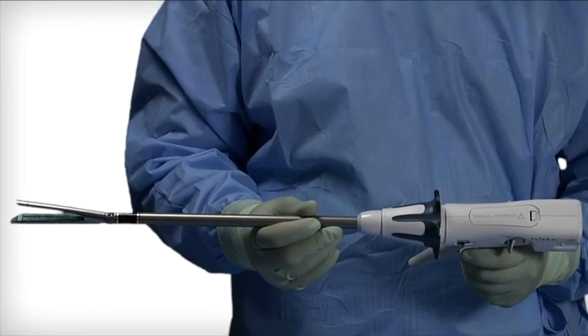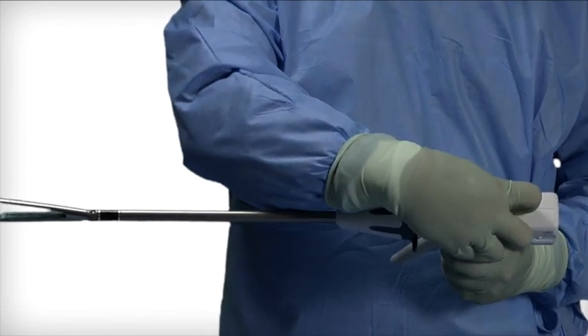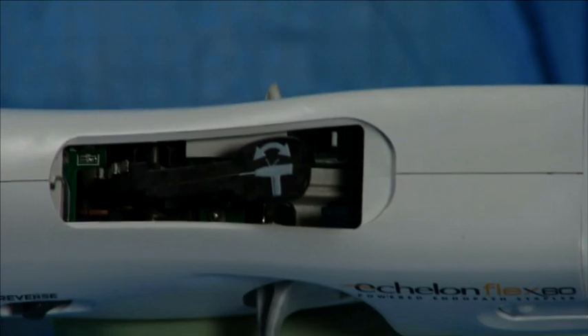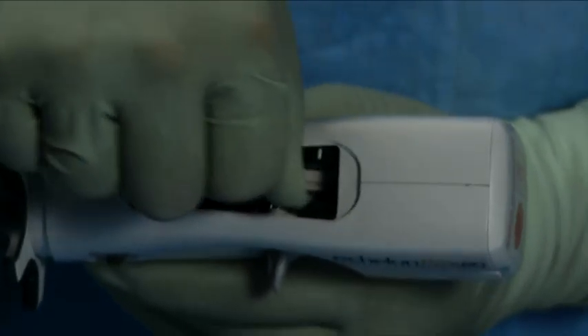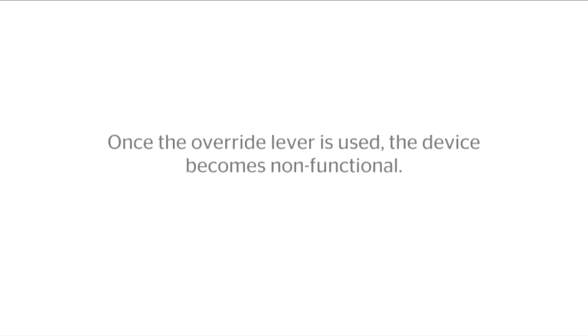Manual override system. This is to be used only if the reverse switch does not return the knife blade. Remove the access panel labeled manual override on the top of the instrument handle to expose the manual override lever. Apply force to move the lever forward and backward until it can no longer be moved. Note: once the override lever is used, the device becomes non-functional.